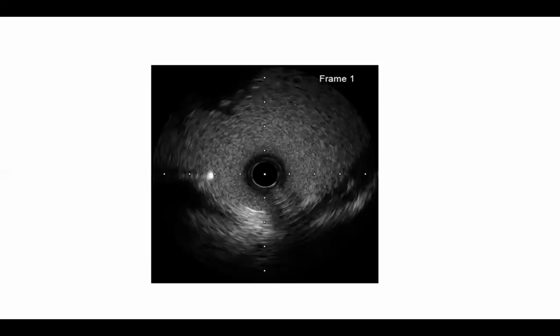I think it could be that the patient has been having dynamic obstruction. There could be a possibility of a little thrombus there that we never saw with IVUS. And by the time that the IVUS probe went there, the thrombus disappeared, or with the contrast flow, we couldn't see the thrombus anymore. But certainly, a 5 millimeter square narrowing is enough to give patients unstable angina. Although it wasn't an occluded left main, it could have been almost occluded or critical because of thrombus a few hours ago or a few minutes ago.